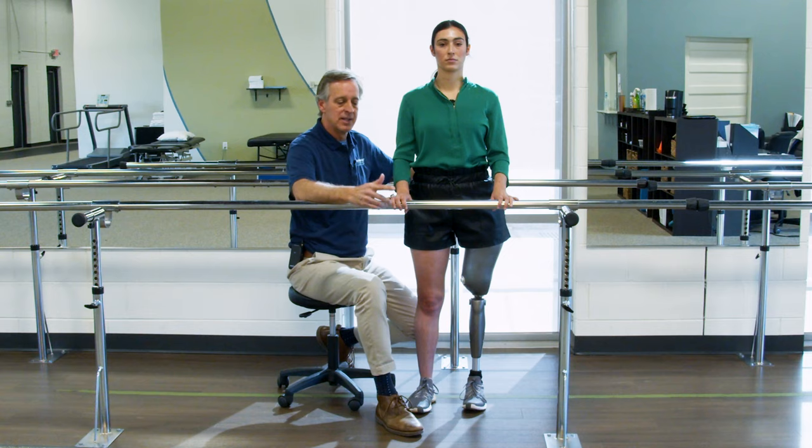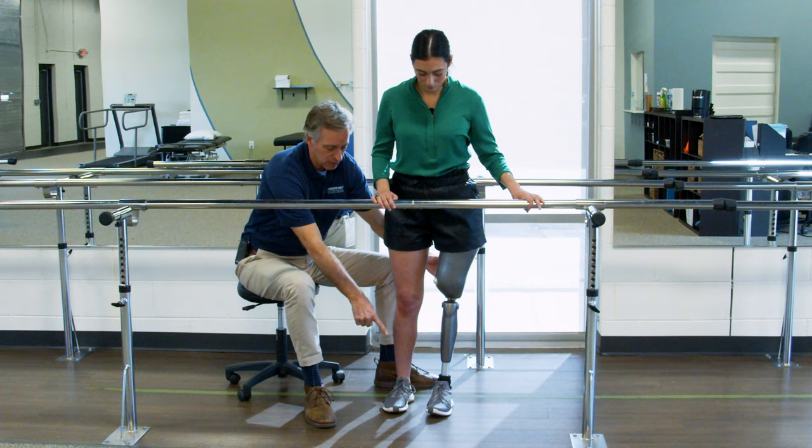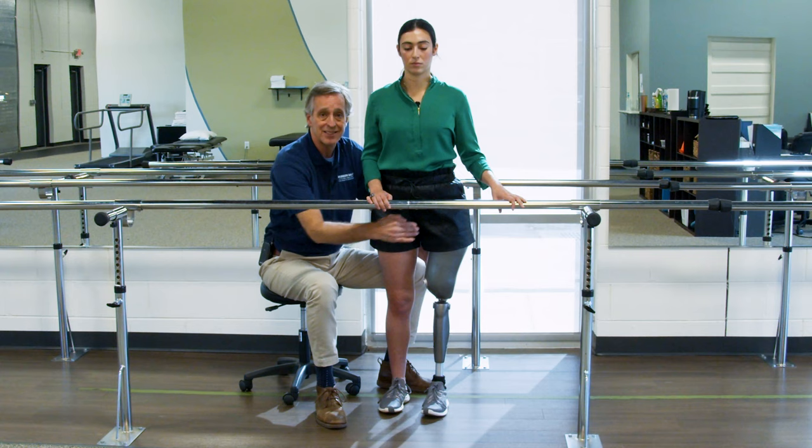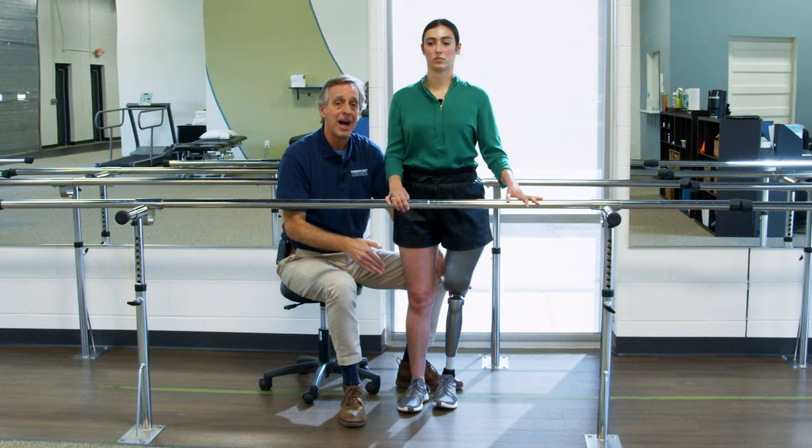So first of all, Tracy, all I want you to do is step towards me with your right foot. Good. And then she's going to step toward me with her prosthetic foot. What's going to tend to happen is if you look at her prosthetic foot, it's going to end up out in front. And many times when she steps forward, because of some tightness in the hip flexor, that thing is going to end up out in front. So every time, step it back out, Tracy. When you bring it in, you want to think about step in and back. So it's actually level or even behind your other toes.